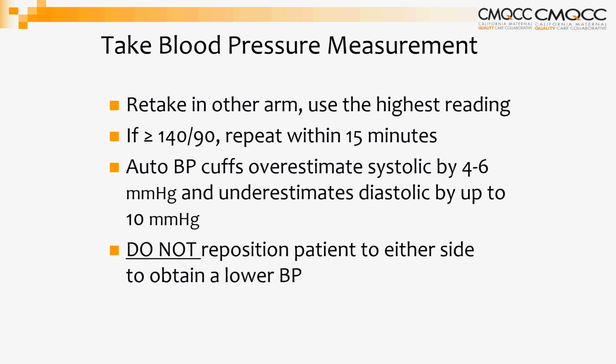Be careful when using automated blood pressure cuffs because they can overestimate. So again, if you're getting into that range of hypertension, that's where it's important to be able to either repeat or use a manual blood pressure sphygmomanometer so that we can ensure that there's not a huge variance between the automated cuff and the manual cuff.